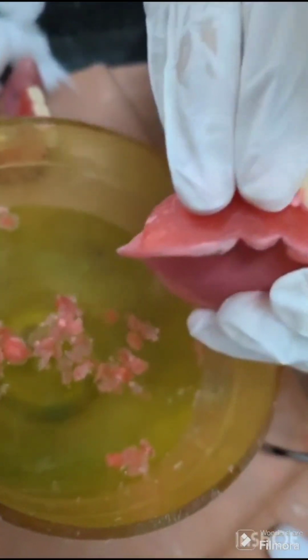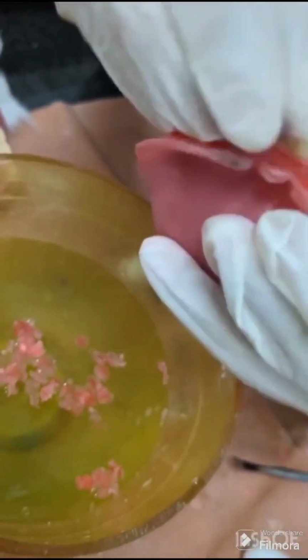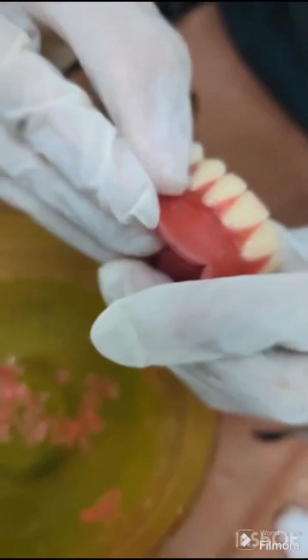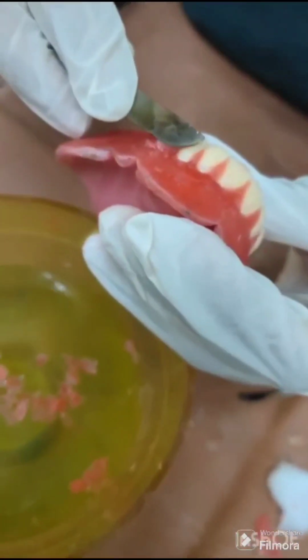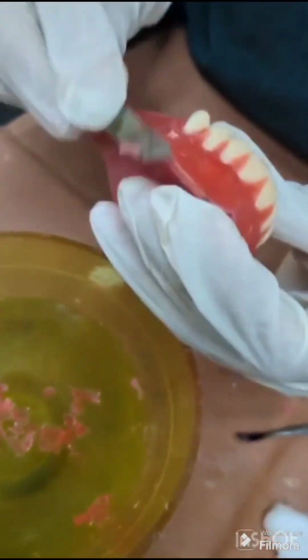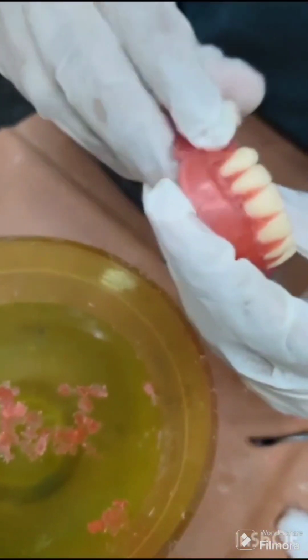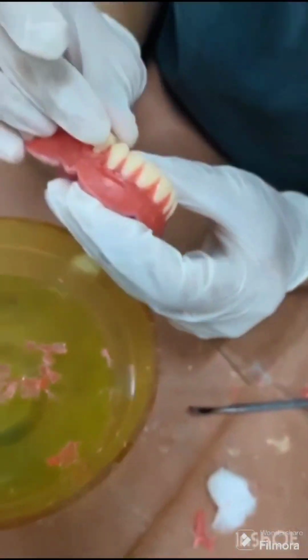The buccal surface of the premolar is in line with the labial surface of the canine. Next, moving to the maxillary second premolar, its long axis is parallel to the vertical axis, similar to the first premolar. But both the buccal cusp and the palatal cusp contact the occlusal plane. From occlusal view, the buccal surfaces of the first and second premolars are in line with the labial surface of the canine.